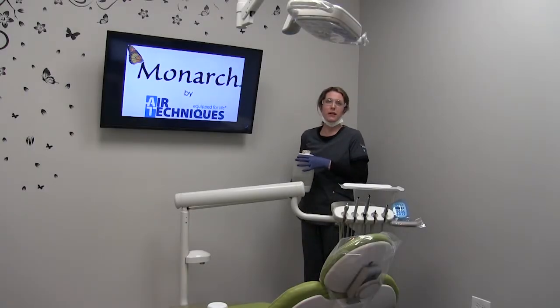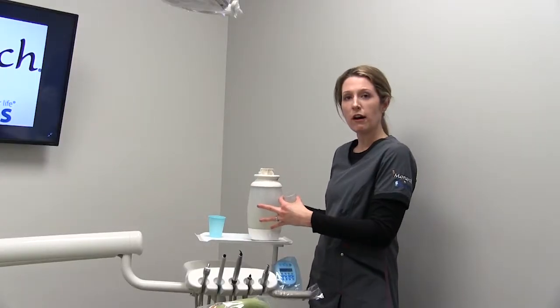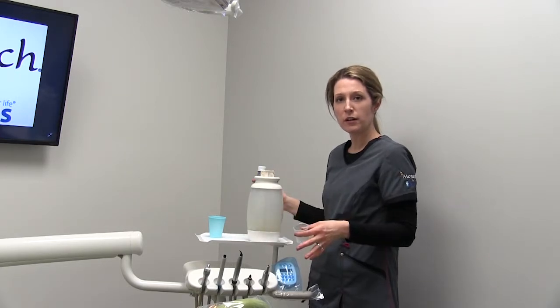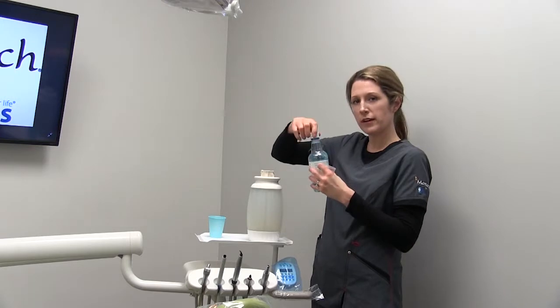Hi, I'm Carly Fish, Monarch Sales Specialist for Air Techniques, and I'm here to show you how easy it is to use our Monarch Water Lines Cleaner. What you'll first want to do is go ahead and take your bottle off the chair. Once you have your bottle off the chair and your water lines have been purged, you'll go ahead and open up your Monarch Water Lines Cleaner.